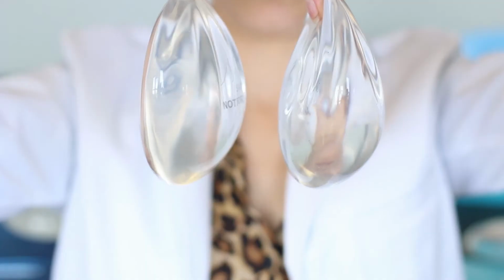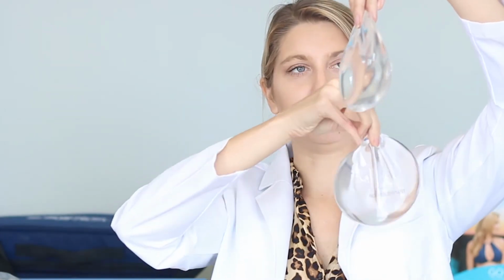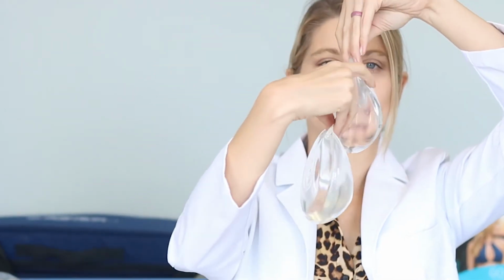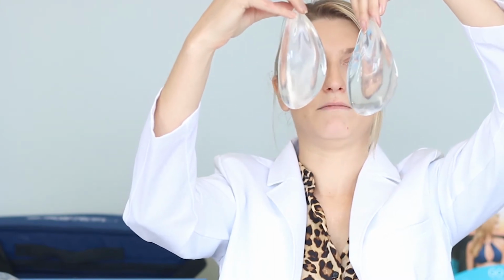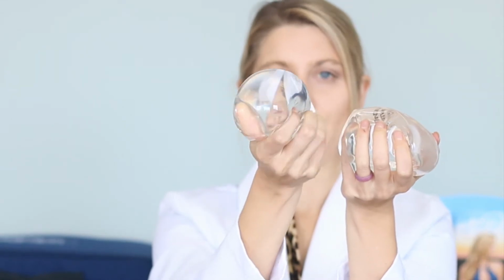The next step up is a soft touch. So I'm going to hold these up right next to each other, and you can see how this one's going to sit a little bit more in a teardrop shape. It does have a little bit more rippling up here, whereas this one sits a little bit more rounded and has a little bit less rippling. Also, whenever you squeeze them, this one is a lot softer, this one's a little bit firmer.